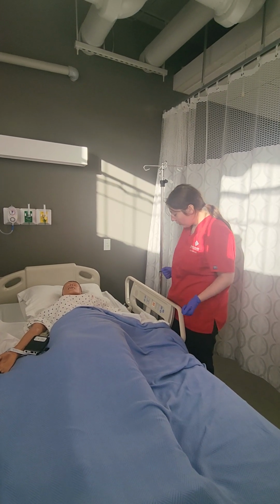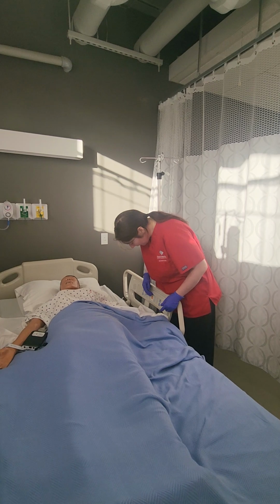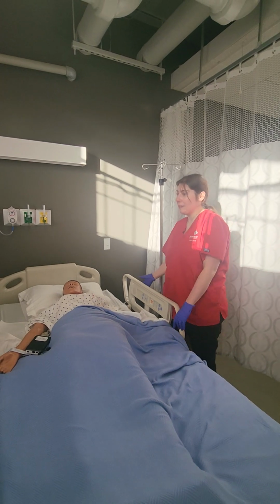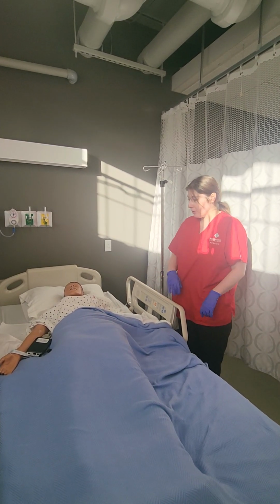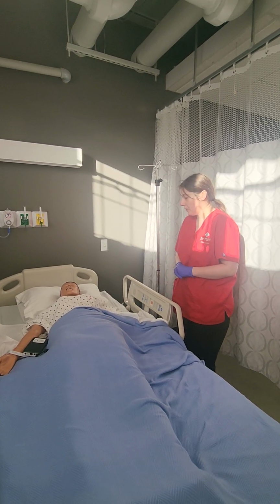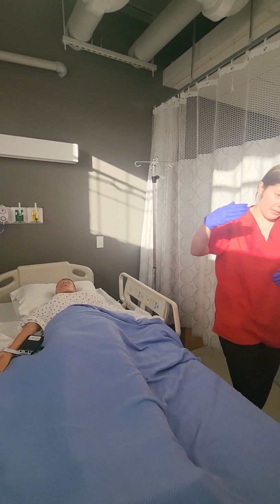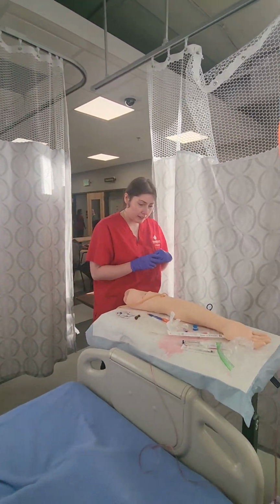No problem. Okay, well, I'm going to get you at a comfortable height for me. So I'd sit him all the way up. Get your arm up to an area where I can reach it, and then I'd look for a good spot on your arm. Make sure there's no contraindications, no AV fistulas or anything, and then I time lapse over to my table over here.